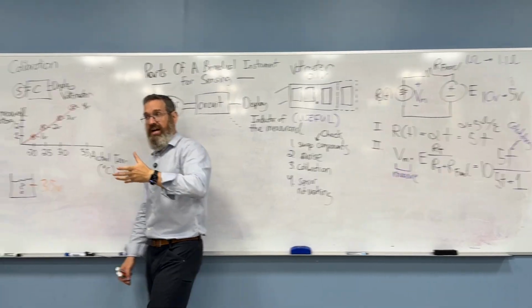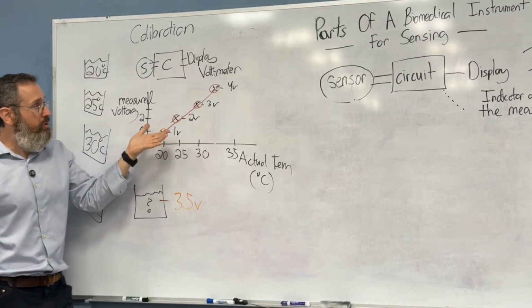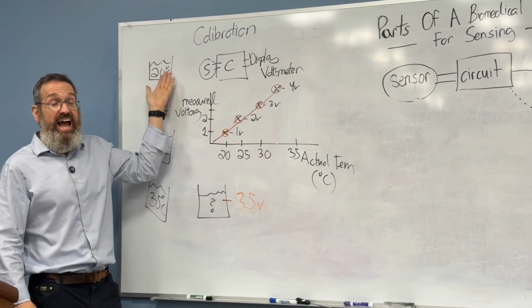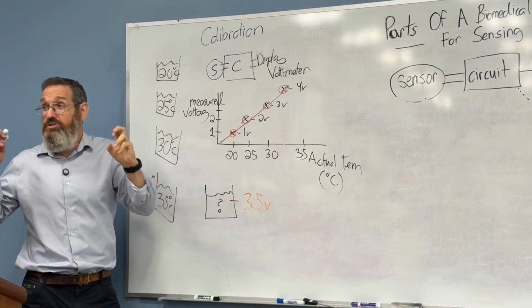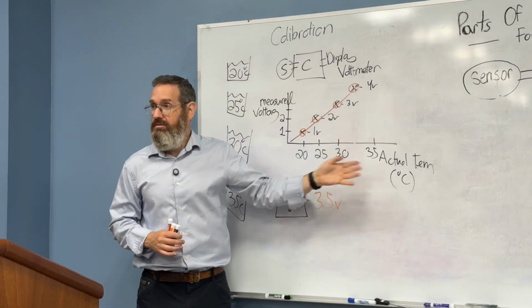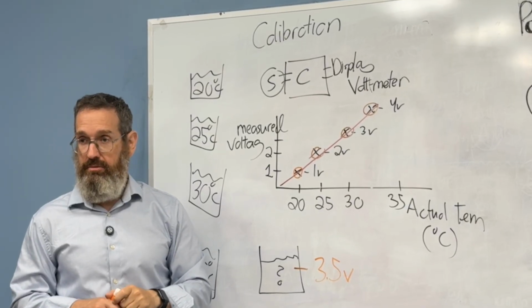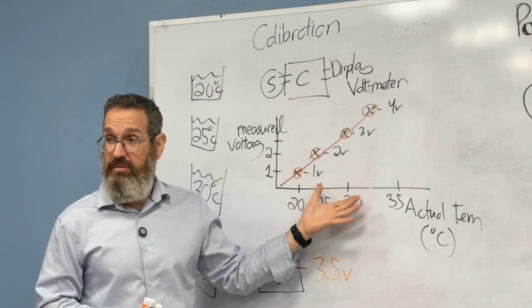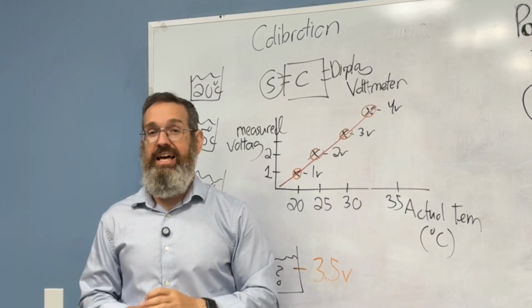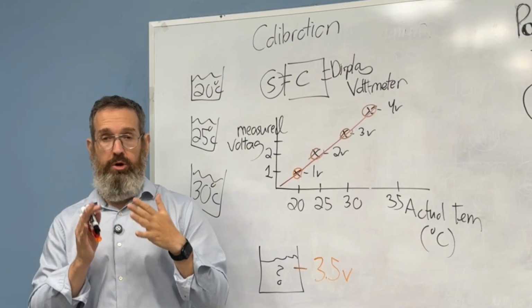This is one use of a calibration. I'm simply relying on, I've calibrated the device using the gold standards, and that's what I'm going to rely on. Here's the question. It is absolutely critical that you report the correct temperature.